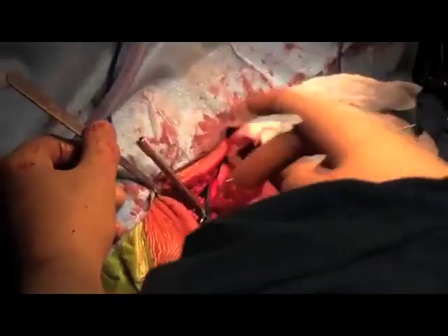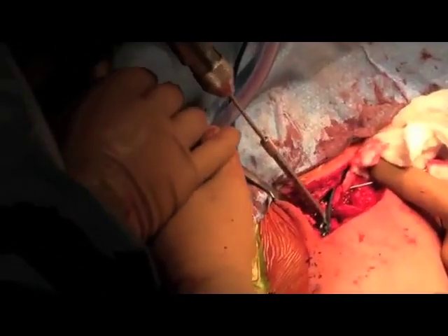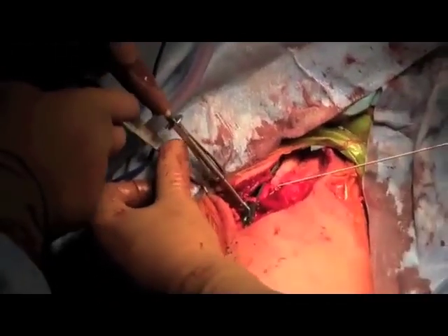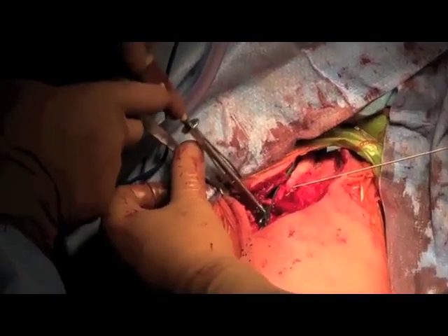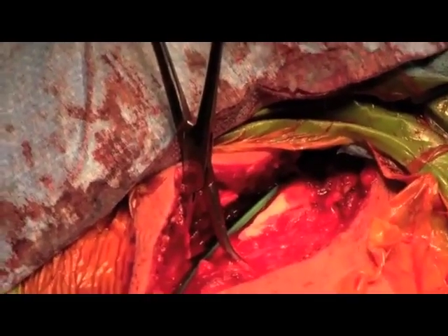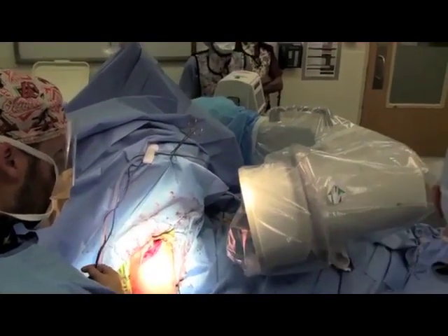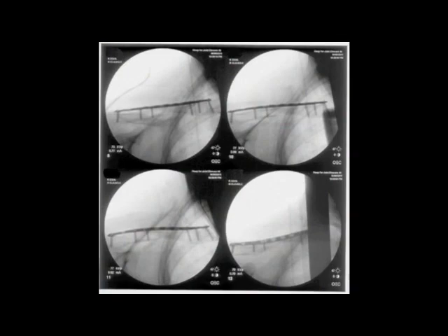At least 3 bicortical screws should be placed on either side of the fracture, especially if no lag screw is utilized in the fixation. Following completion of fixation, final radiographs confirm final implant position and screw lengths.